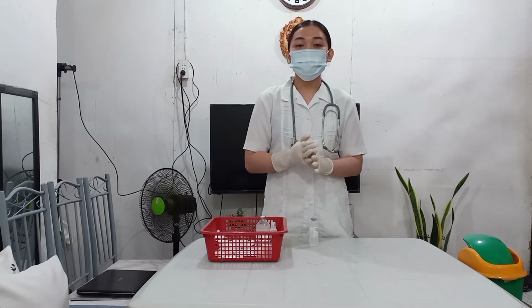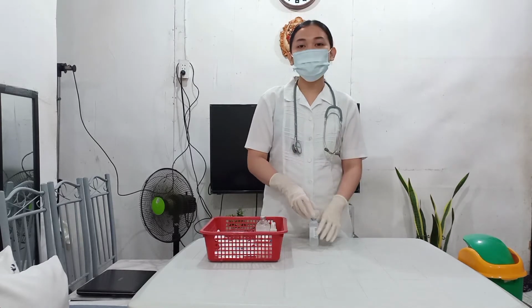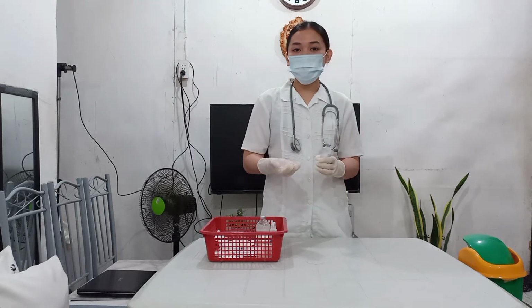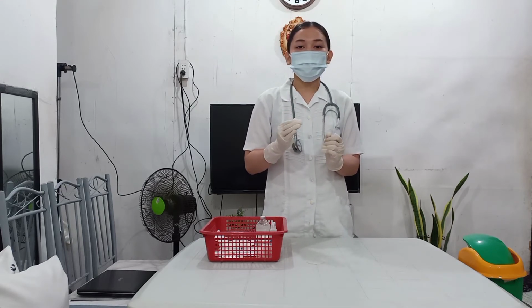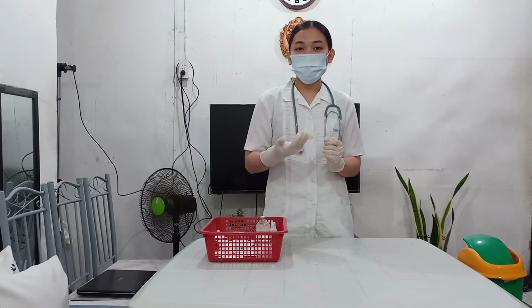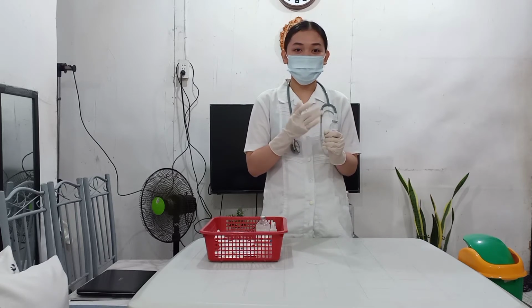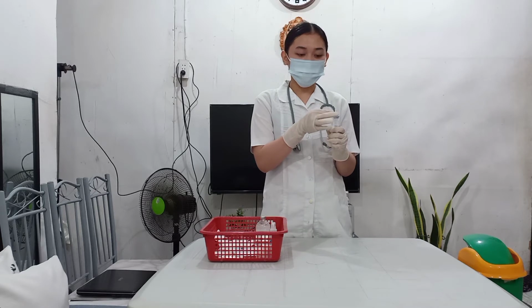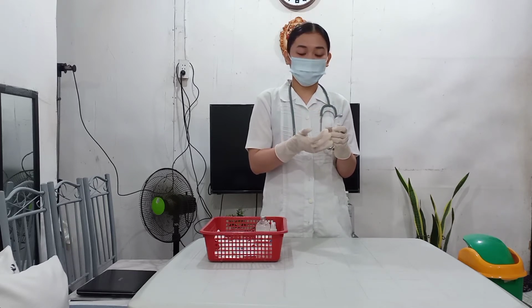Now, this can be applied in the glass ampule. Since I am using a plastic ampule, there is no need to flick the ampule. However, for the purpose of compliance in this return demonstration, I am going to show how to flick the ampule, assuming that this is a glass ampule. So, you are going to flick it several times until the medication drips off to the body of the ampule.